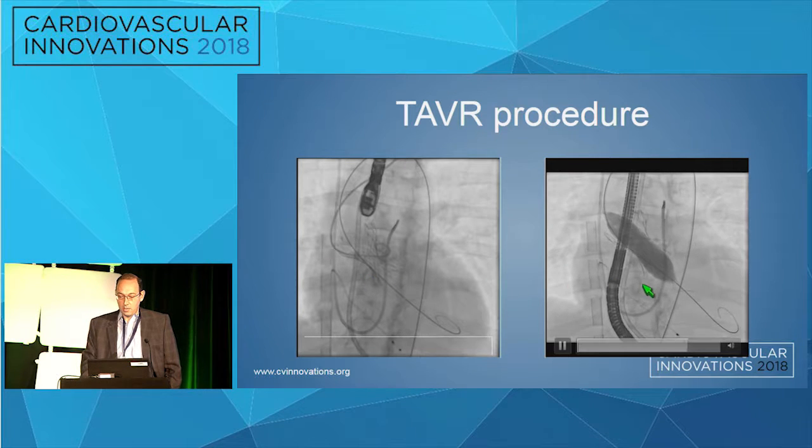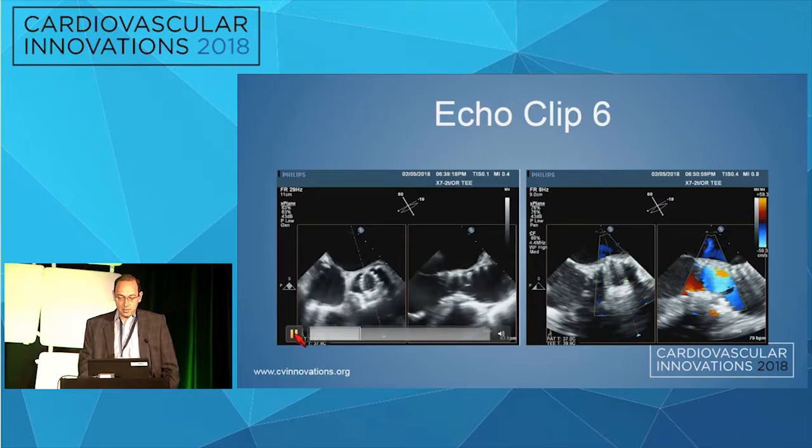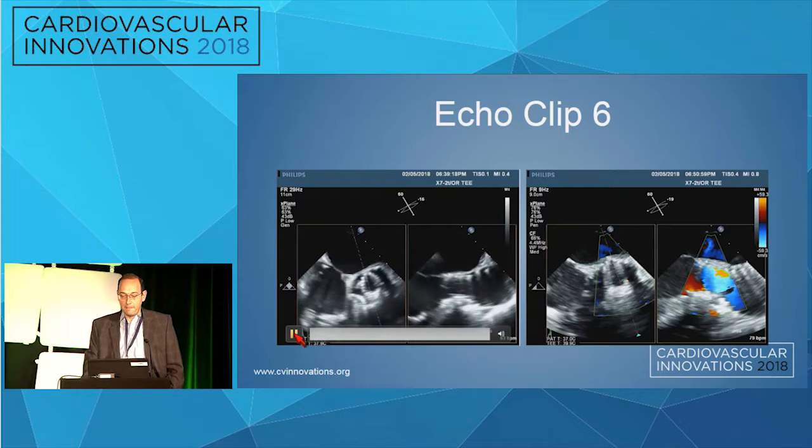And you can see the valve is touching the annulus. It's not necessarily a deep implant. It's not as high. We usually implant them a bit higher, but we thought it was an acceptable implant. And this is how it looked on TEE.